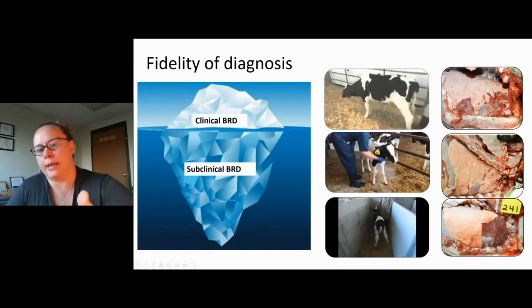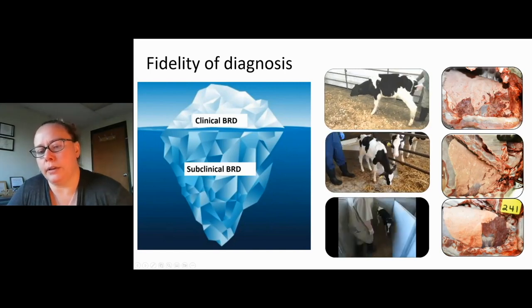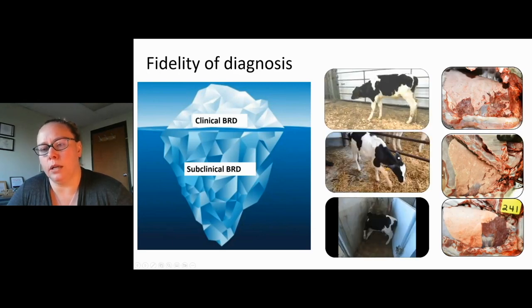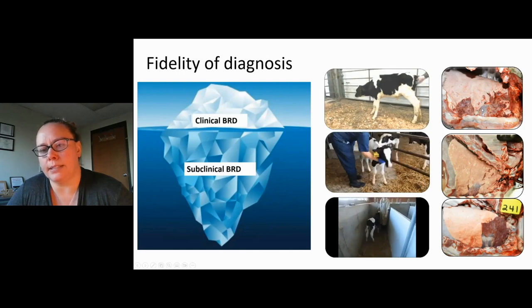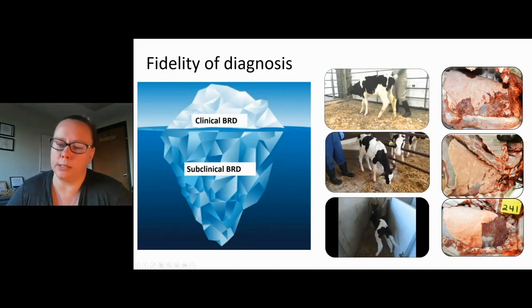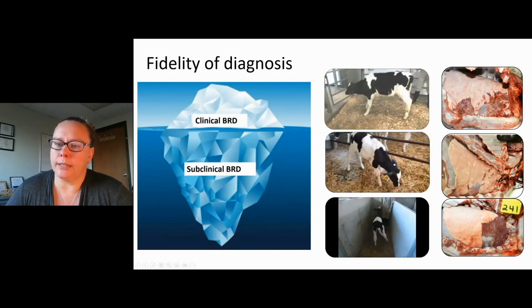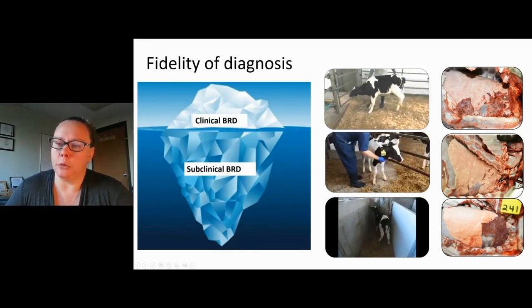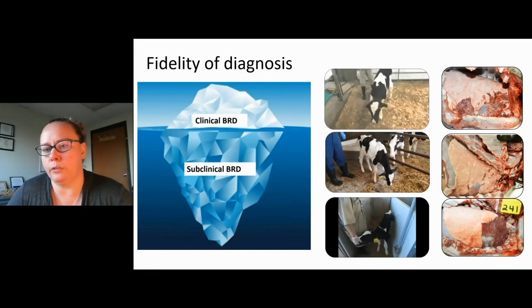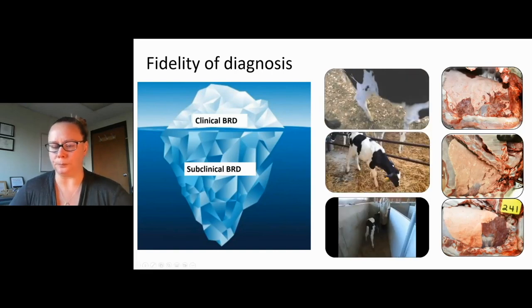And so we've lifted the rib cage up and we're looking down into that right lung, where we have one lung lobe that's completely consolidated. It's red and firm right here in front of the heart, which is located right here. We have a normal lung lobe right here just behind the heart. Then we have a second lung lobe that's completely consolidated here behind the heart, and then more normal lung up here towards the back. So for this first calf with 2 lung lobes completely consolidated like that, because each of these lung lobes is roughly about 6% of the mass of the whole lung, we can say that there's 12% of the lung affected in this first calf. Okay, hopefully that makes sense to you.